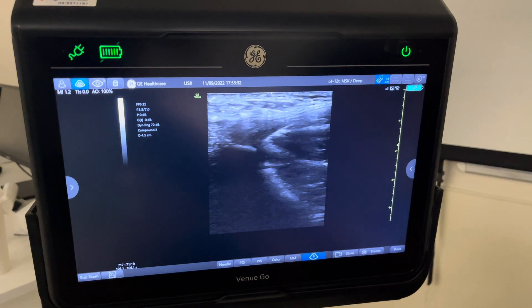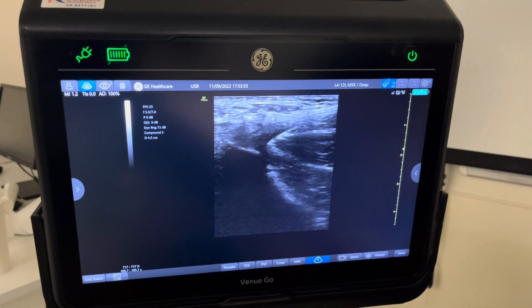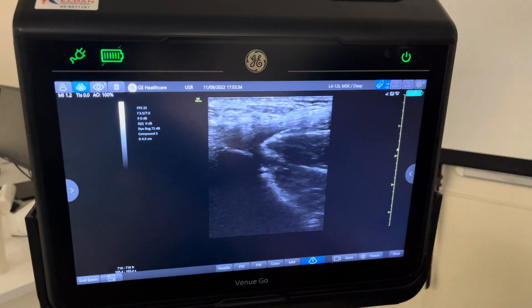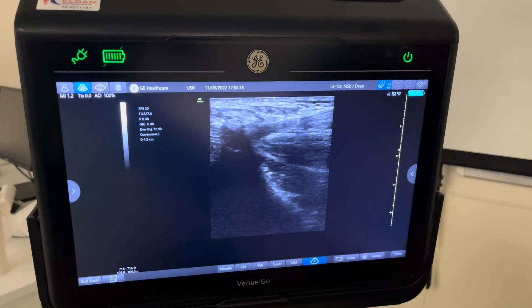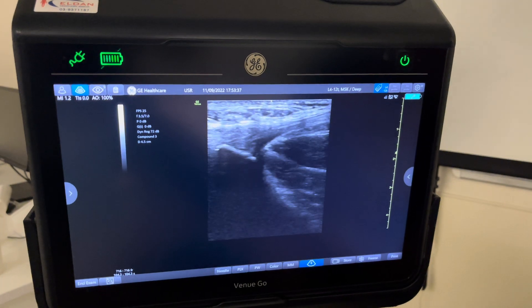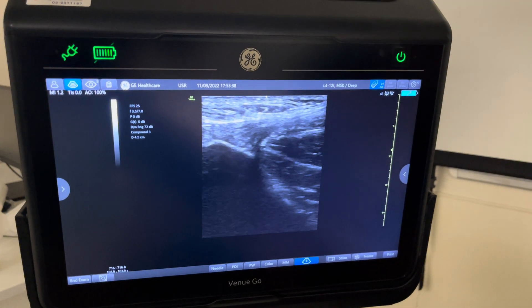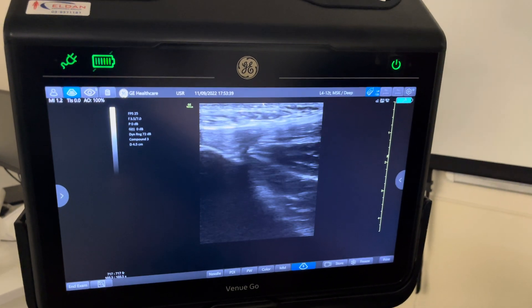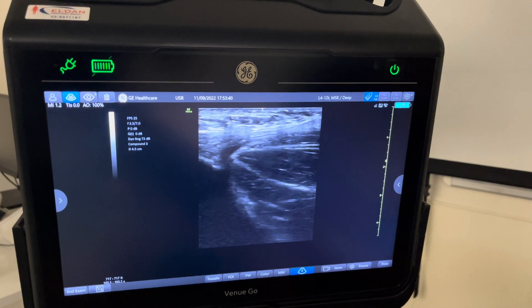In this case you can see it beautifully. Sometimes you can get a bit of anisotropy, so you have to play around with the angulation of your probe a bit to get a good view.